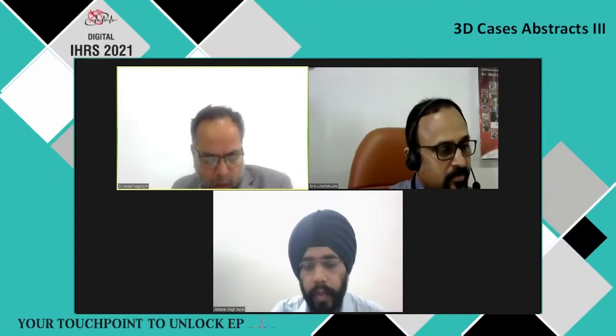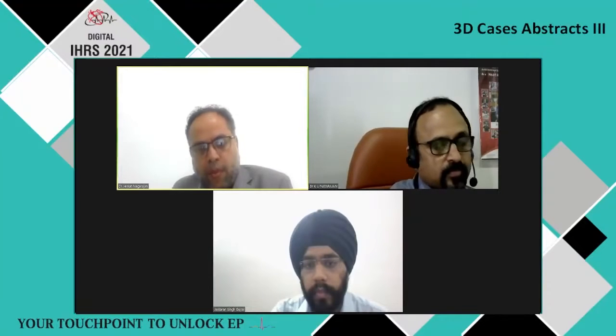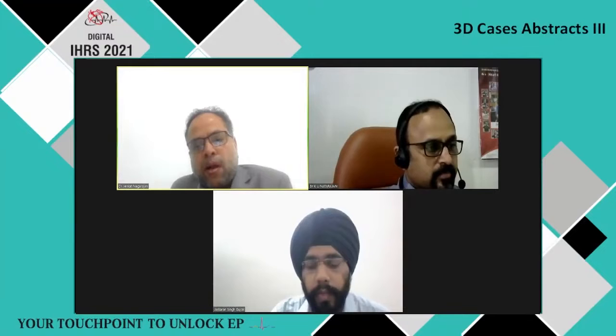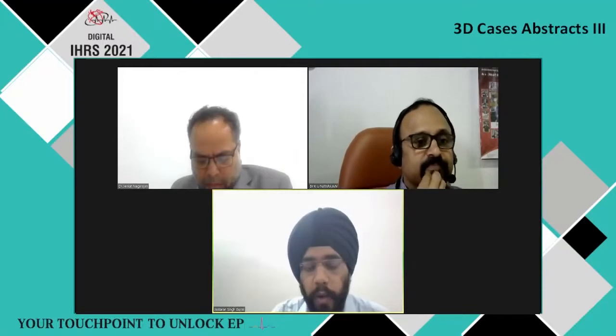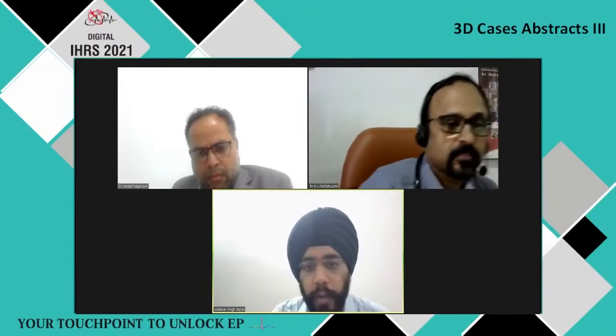So I just wanted to know what made you choose this form of mapping, isochronal late activation mapping. What was your thought process in choosing this mapping methodology? So, the patient had severe LV dysfunction because of anterior wall MI. The whole of the anterior wall and the septum was scarred. So we thought the VT was unstable. All 3 episodes occurred with syncope. The third one was on drugs, on maximum doses of amiodarone and beta blockers.